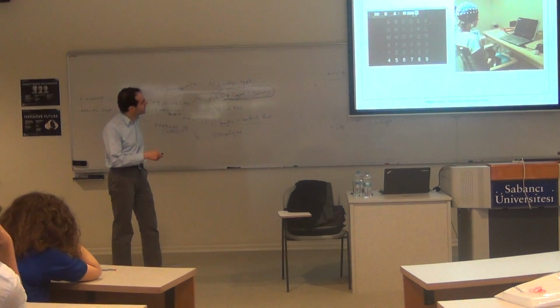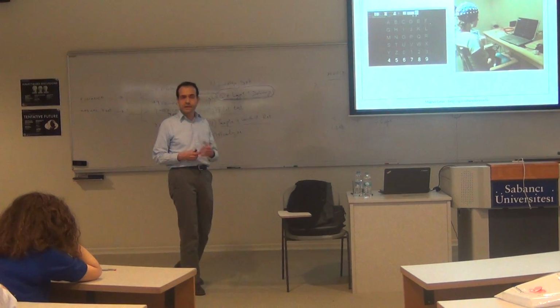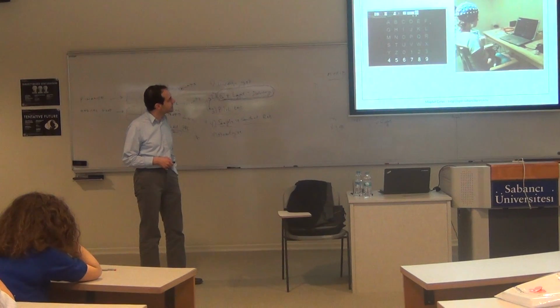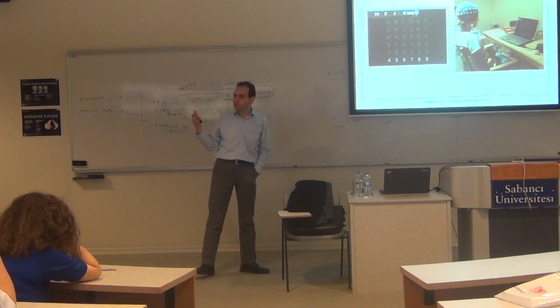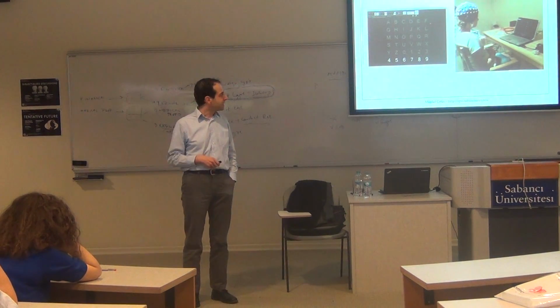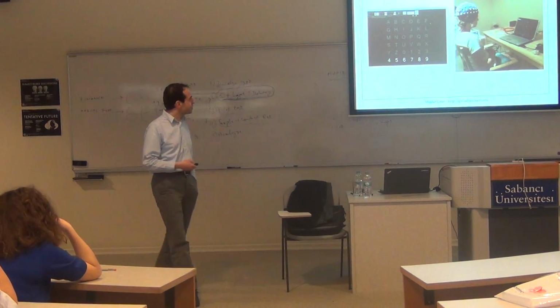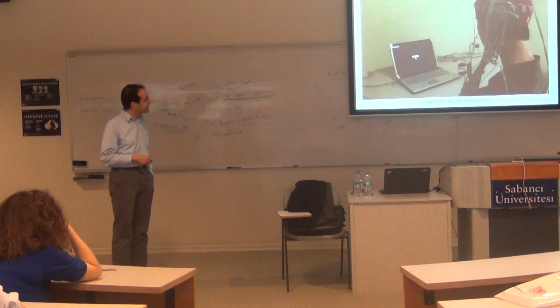So we developed spellers based on P300 signals, and different students have developed different things on this system. The first thing I showed at the start was our initial system, just using the EEG data, using a simple classifier to make decisions, and it works. But as time went on, we wanted to make other academic contributions, and one of these is using language models.